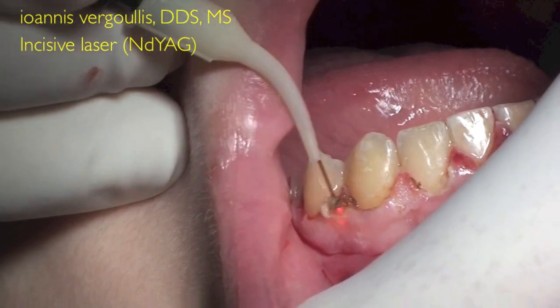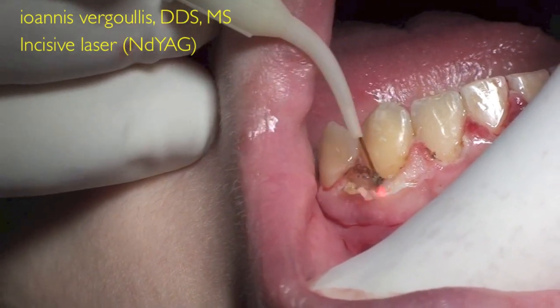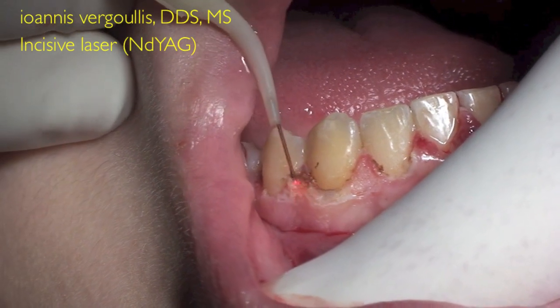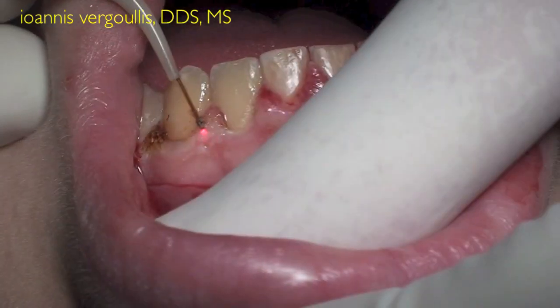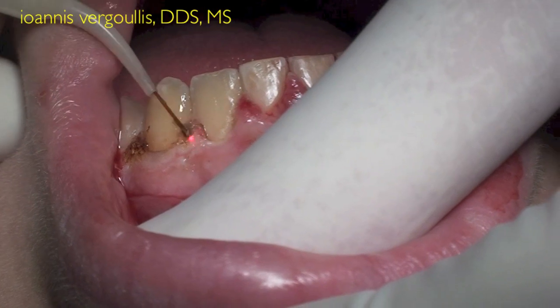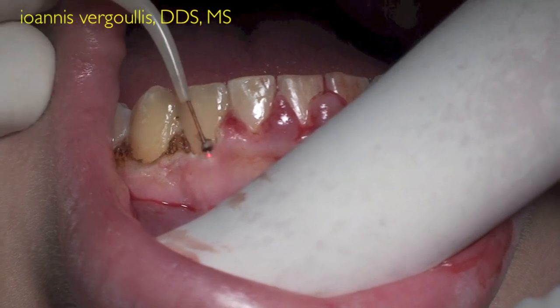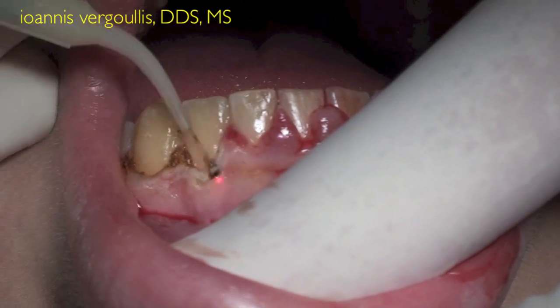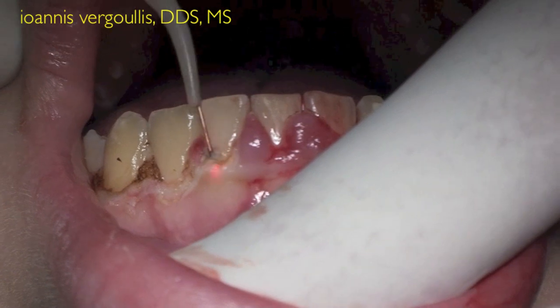And for this reason, we utilized a laser. In this case, we utilized an NdYAG laser with a setup of 4 watts. The laser gives us some certain advantages, such as better control, especially during the gingivoplasty, and also much less bleeding throughout the operation. Some patients also report less discomfort and faster healing process when we utilize a laser compared to utilizing a scalpel.